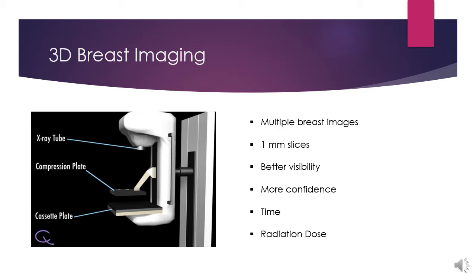The time frame for 3D breast imaging is probably just a very few seconds longer than what the 2D breast imaging was. So it's really not hindering the patient. And the radiation dose is fairly low. It's still consistent with what a mammogram was back when they used film.